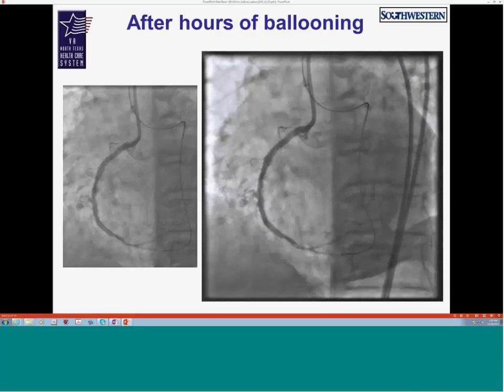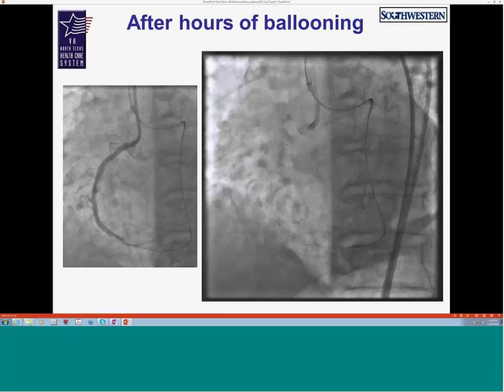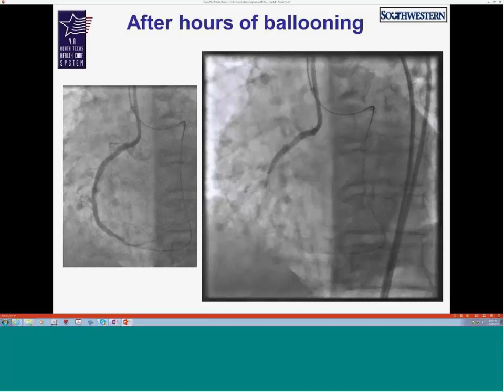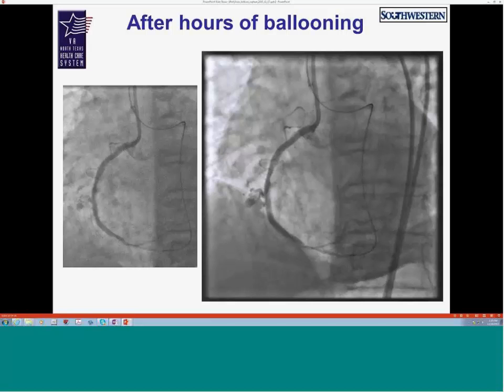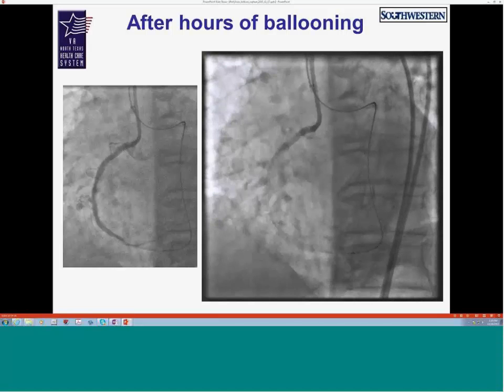So in any case, I think I spent at least 2 hours ballooning, and we actually ended up putting another stent, an extra layer of stent. There are some reports out there that if you don't have a cover stent, if you put a second stent, maybe it'll move the tissue or cover something or help you get hemostasis. And I can tell you it didn't work.